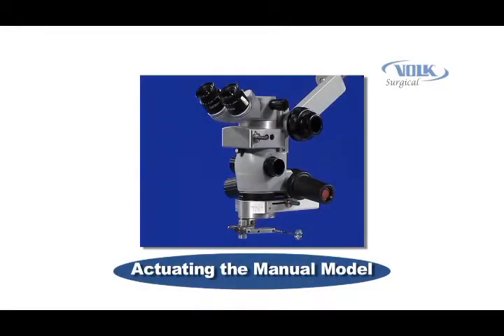This portion of the Merlin Surgical System instructional videos covers the actuation of the manual CLA condensing lens and the manual Rolls Infinity re-inverter prism. The manual CLA and manual Rolls Infinity require their sterilized handles to be attached in order to actuate the devices without risk of contamination. The handles should always be sterilized and available for every case that uses the Merlin Surgical System manual devices.